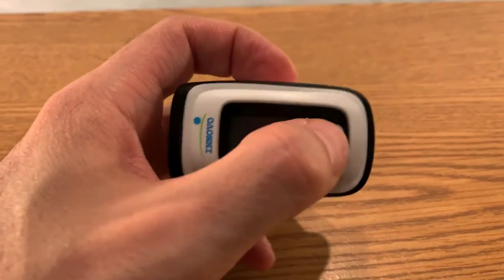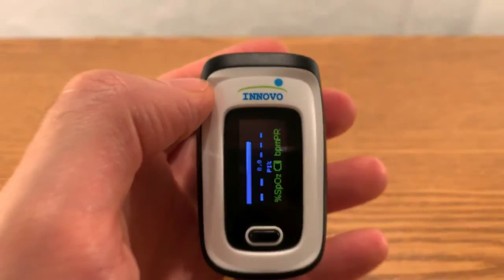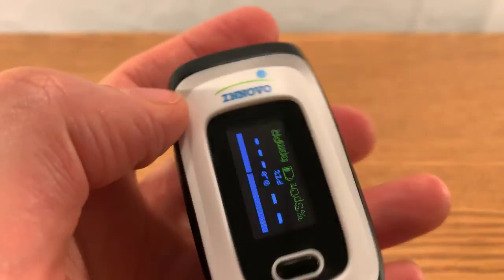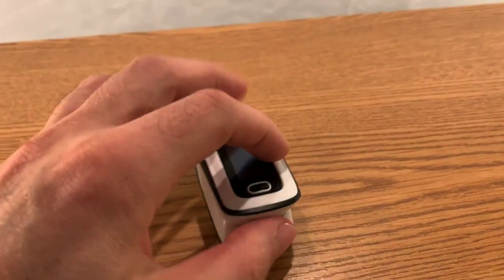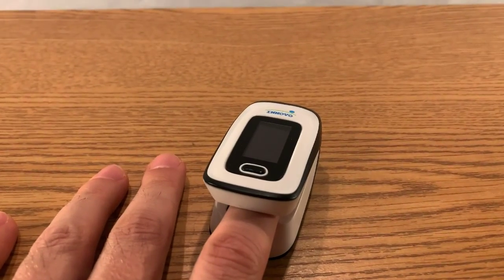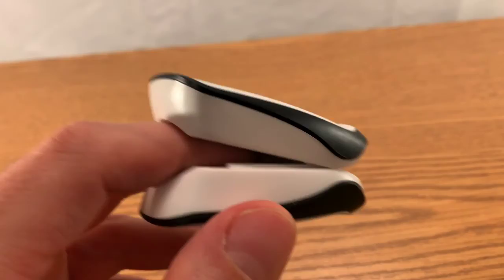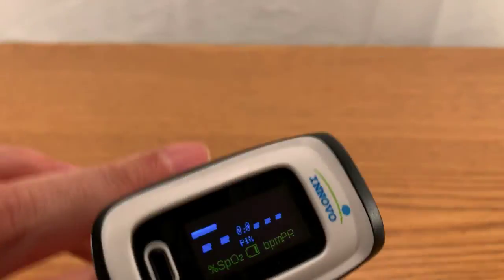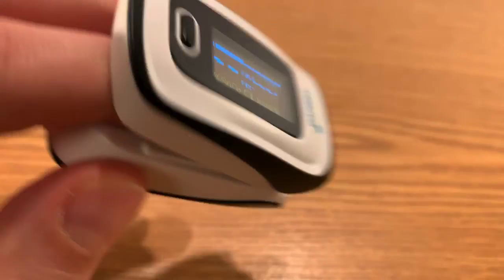This is a really cool thing. iNovo is the company, I believe, and this monitors your heartbeat. I've had this for a while now. It looks like I should replace the battery. I'm going to walk through all these settings.